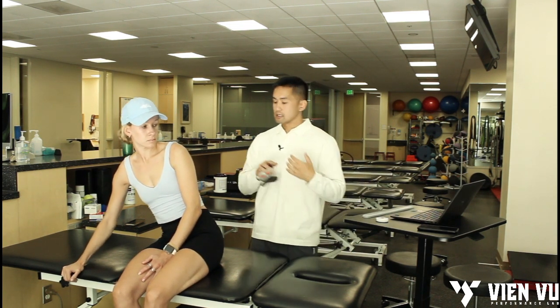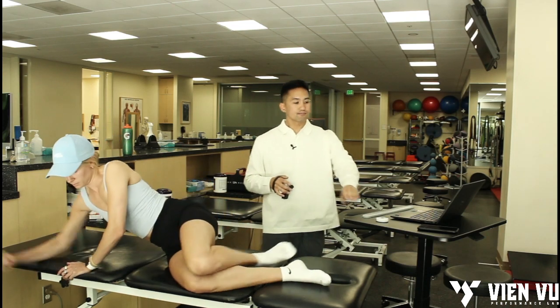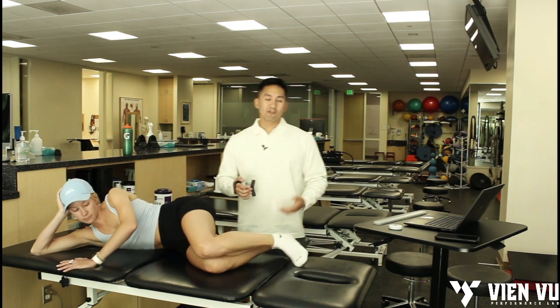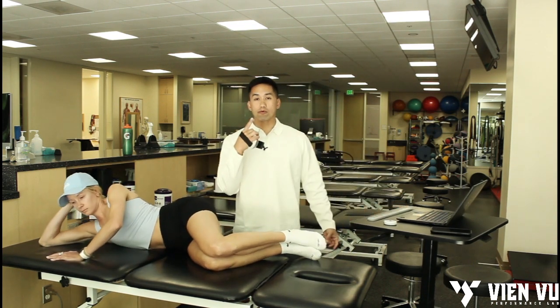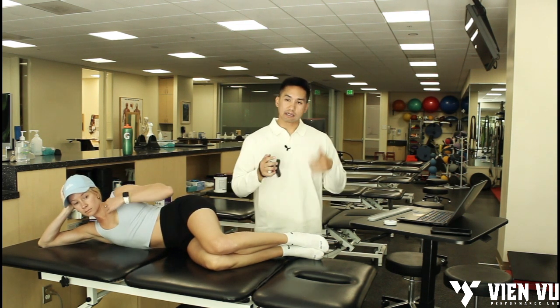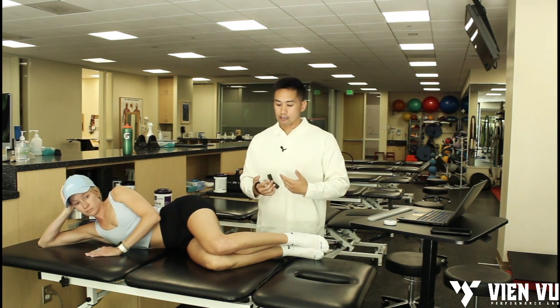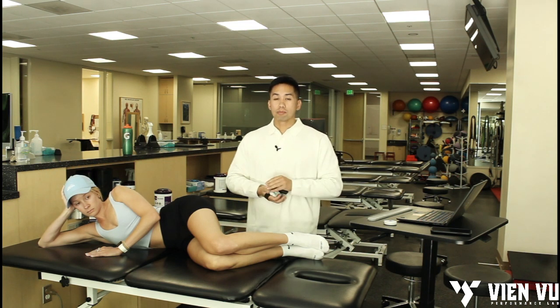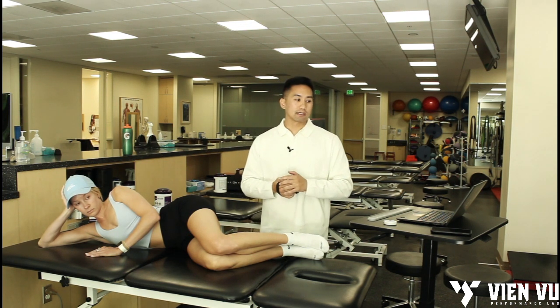We're going to start with testing this athlete — her name is Miss Stacy. We're going to test her left side first. Her injured side is her right, and her uninvolved side is her left. For the sake of this video I'm only going to go through one rep. If you took my course, I go into whether to look at average, max, or how many reps, but for this one we're just doing one rep so you can see the sequence.